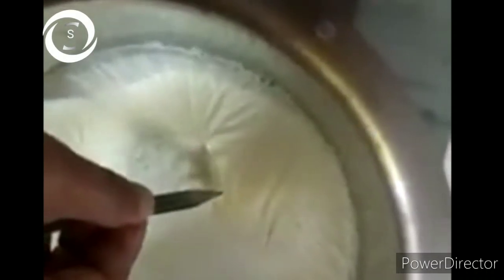The person performing it is exceptionally talented — he does it round and regular and it doesn't extend. We will show you at the end how well he completed it. If you can perform like this, then cataract surgery will be very easy for you. The capsulorhexis has now been completed.